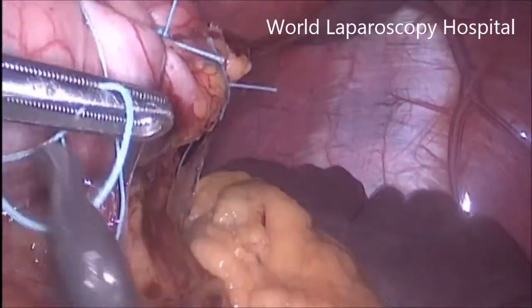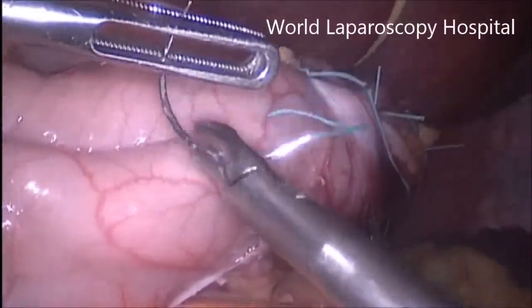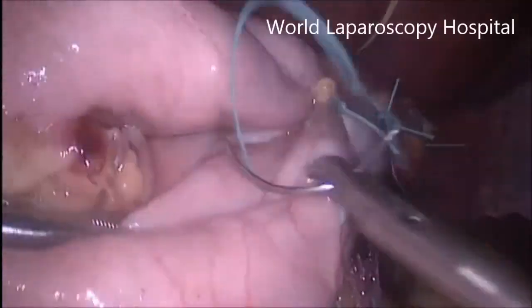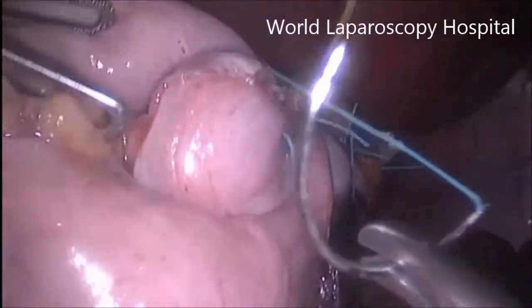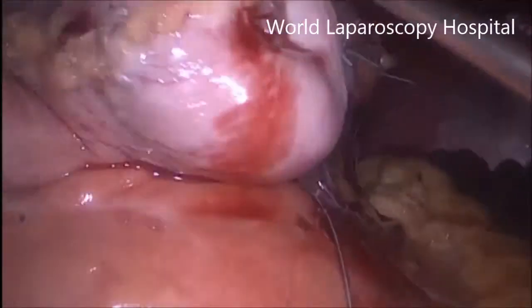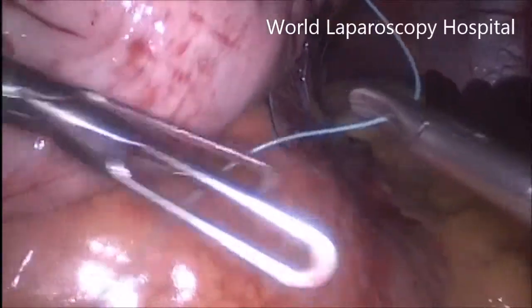With suturing, care has to be taken that no space is left, because one of the problems is collection of fluid in the tubular space which is left, and that's why multiple layer suturing is good. In some of the centers, they have seen that the long-standing result of gastric plication is not as good as sleeve gastrectomy. But now, in many of the series, it is the same as sleeve gastrectomy.